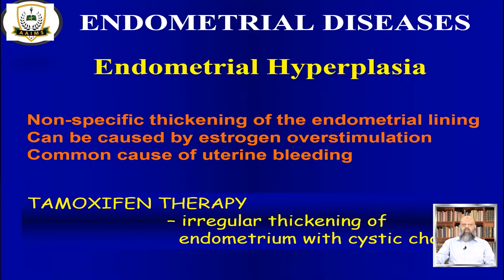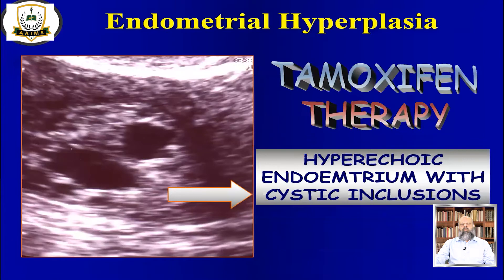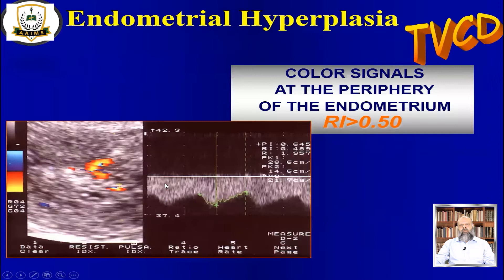In tamoxifen therapy, we can have irregular thickening of the endometrium with cystic changes. This is how it appears — the endometrium is having hyperplasia with cystic areas in it; this was a patient on tamoxifen therapy. When we use transvaginal ultrasound with color Doppler, we can assess the endometrium and its vessels. Here you can see color signals at the periphery of the endometrium; the resistive index is around 0.48. We usually take normal as above 0.50, so in this case it was relatively lower.